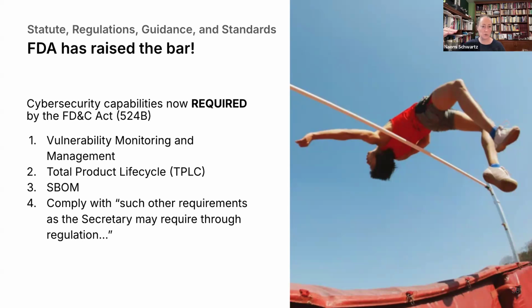Below that are regulations, which are an interpretation of the statute, and those can be argued in court. You can argue with FDA in person, you can argue with them over emails, but those are things that may be prone to some negotiation because they are an interpretation of the law and not the law itself. If it's written in 524B of the Act, just do it. Like, there's your Nike theme. But if it's in regulation, there are times where there's some flexibility, some wiggle room.